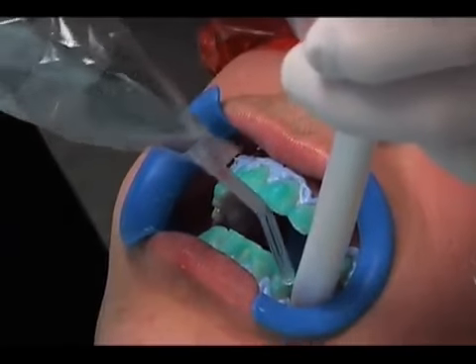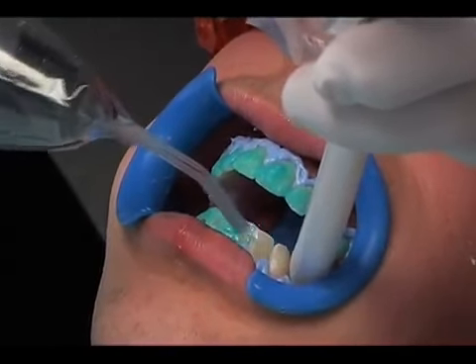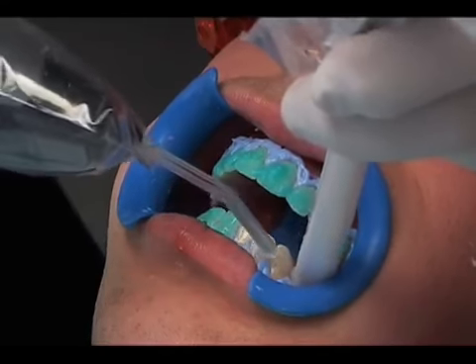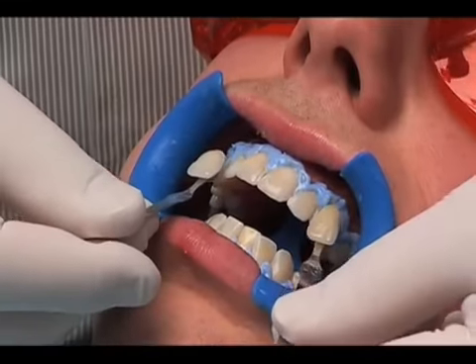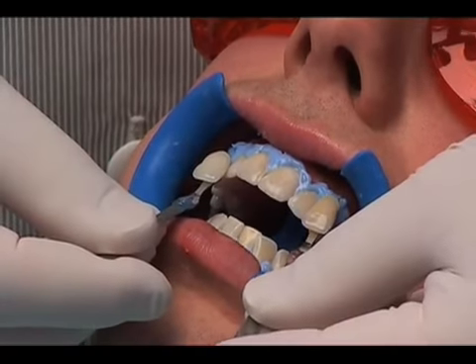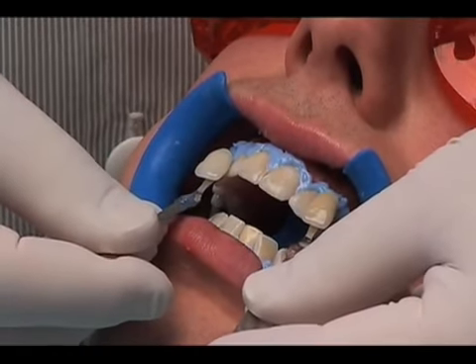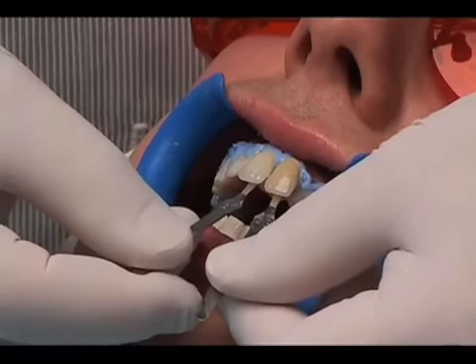After the last application, suction off the remaining gel and use your air-water syringe to rinse the teeth. Use your high-speed evacuator to suction as you are rinsing. Make sure the whitening material does not enter the oral cavity. Together with the patient, record the post-operative shade and compare it to the pre-operative shade. After only 2 applications, the teeth of this patient lighten from A3 to B1 shade.